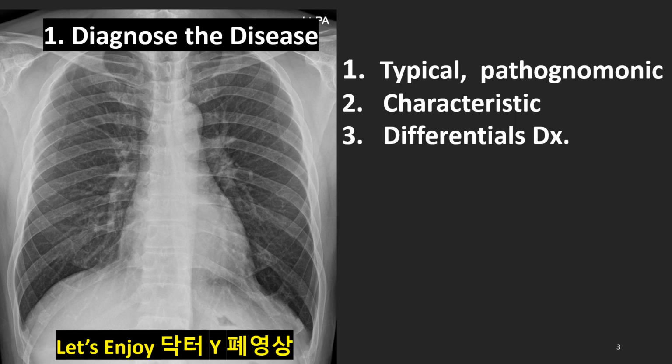As you all know, doctors, especially radiologists, like to say typical findings of chest x-ray or CAT scans. Also, the pathognomonic findings of the lesion. And sometimes we like to say characteristic findings of the chest x-ray and CAT scan images. These efforts may lead us to better diagnosis and better cure, but sometimes this attitude may mislead us to wrong answers.